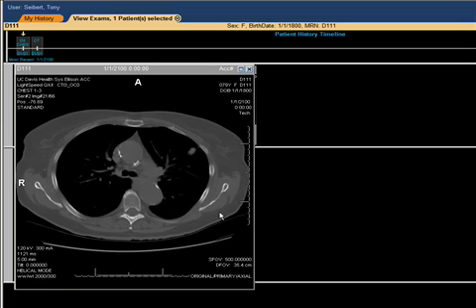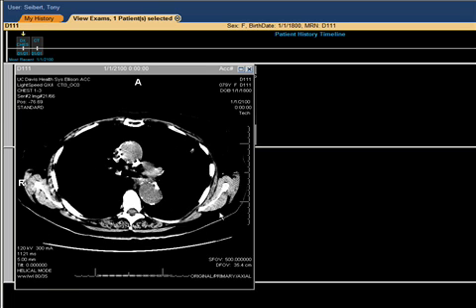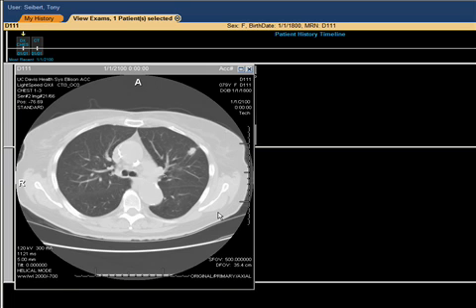By changing the window and level characteristics, there are a wide variety of different display options. It is crucial at this point to ensure that the grayscale is rendered properly. Here we have the proper grayscale rendition.